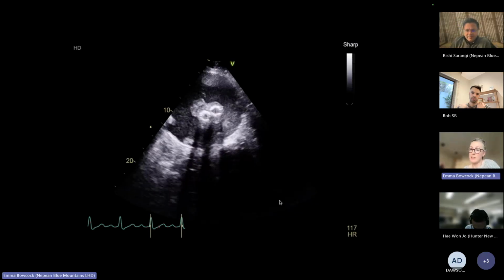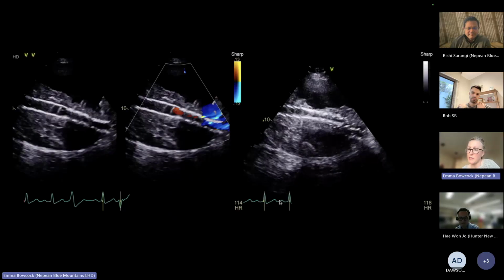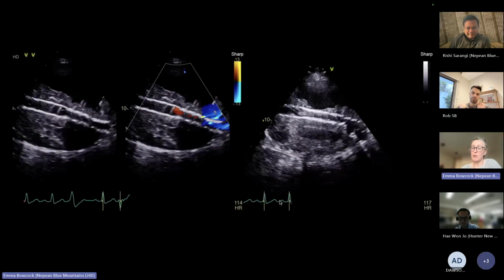He completely occluded the left side, so he had an ischemic left leg and developed compartment syndrome of that left leg. So this is actually after the embolectomy and the stents and things. They've actually fixed the problem, but there probably is still a little bit of thrombus in that left-sided graft. I didn't tell you which one that is, but that's the left-sided graft there.